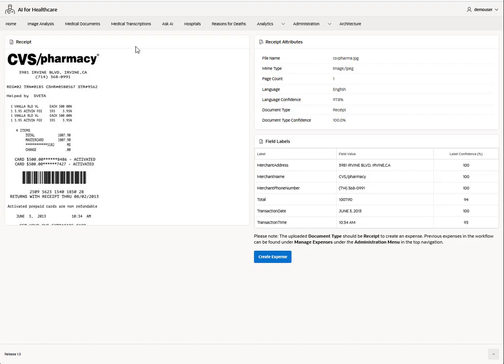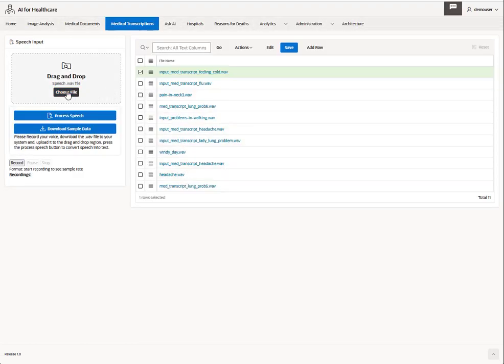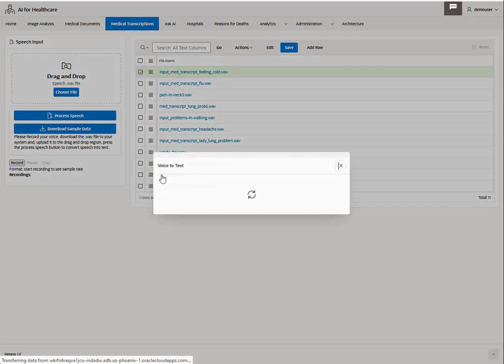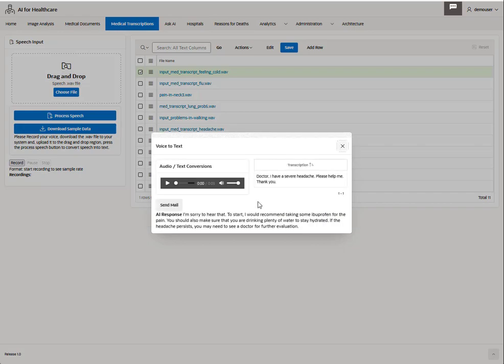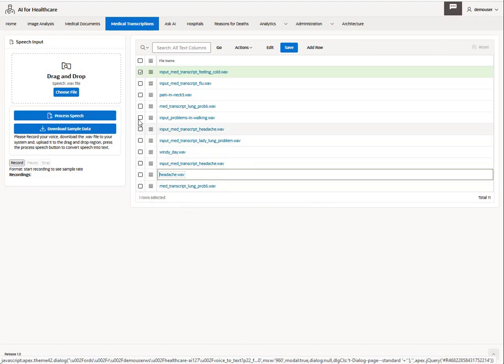In case hearing or seeing is a challenge, we also have a medical transcription feature in the AI for Healthcare app that will allow you to record speech or upload a WAV file to convert to text. Select the file and hit process speech, or you can see one of the ones we've already included. You can also play this file or send it in an email. If you don't have a file that you can upload, you can also record in the browser and choose that file to upload and process.